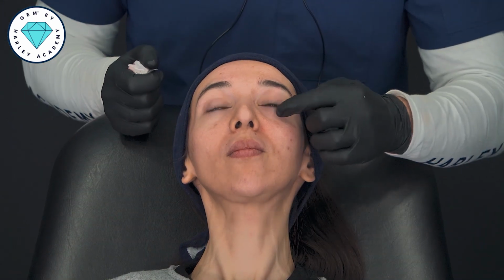So look, we've treated the temple, we've treated the apex of the cheek, we've treated the tear trough and the piriform fossa. If I sit you forwards now, I hope we can appreciate in the camera, first of all, the really nice projected shape on this side, but also the support of the maxilla and also the improvement in the under eye and the temple as well. So I'm going to continue now on this side. I'm going to start to structure the lower face, and we'll see if we can continue to add more shape to the face.